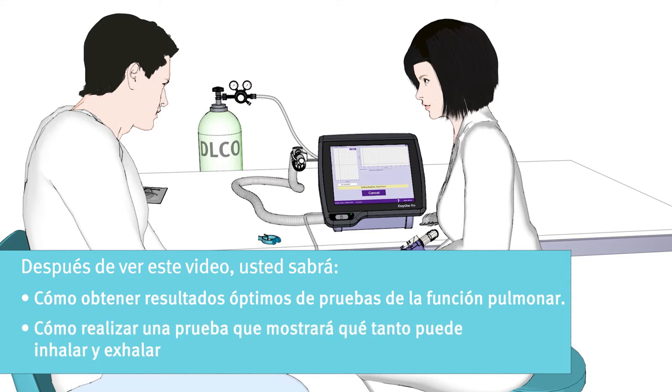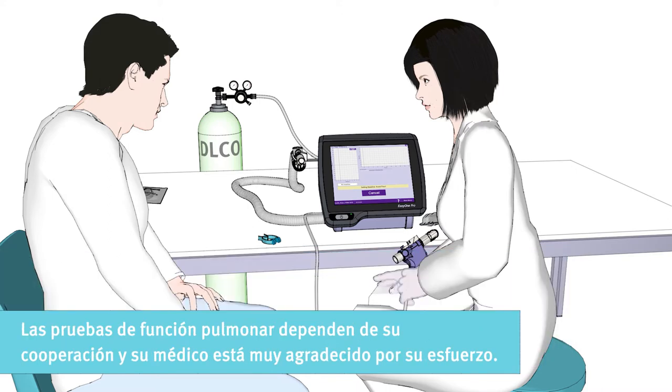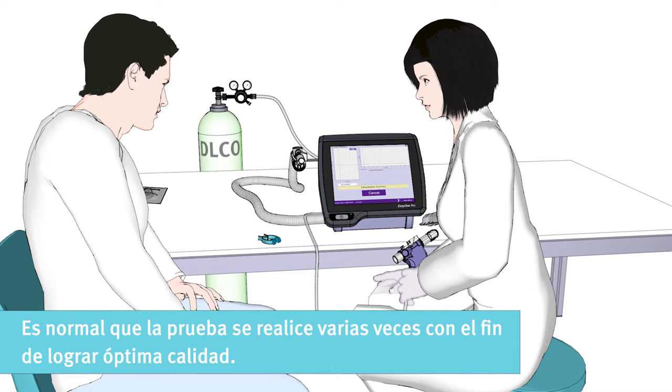How to perform a test that will show how fast and how much you can inhale and exhale. The lung function test is dependent on your cooperation, and your doctor is very thankful for your effort. It is normal that the test is performed multiple times in order to achieve an optimal quality.